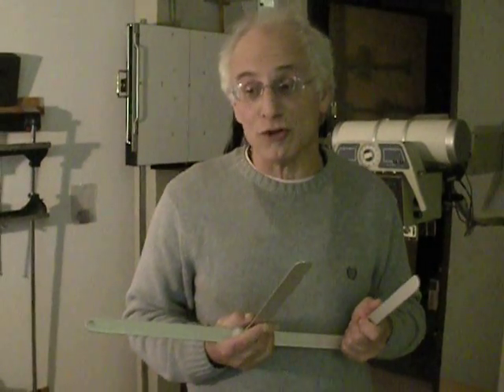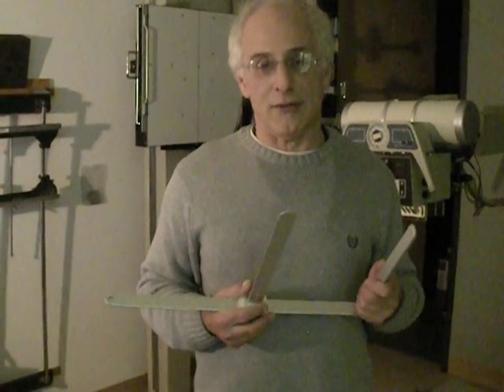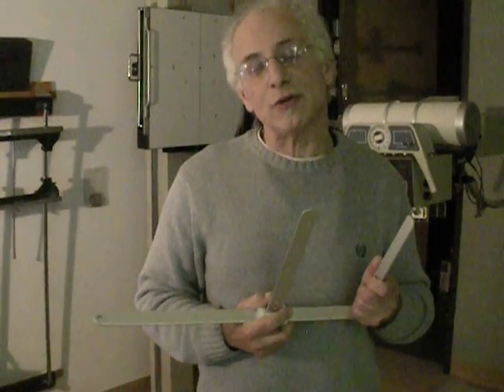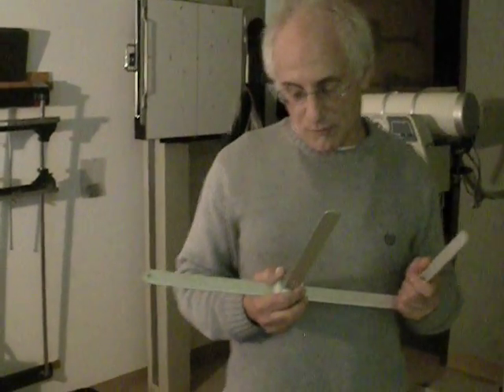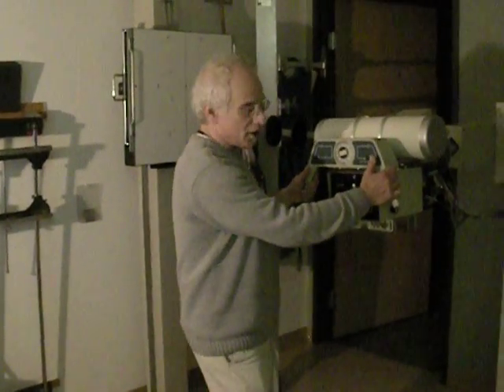We're going to begin with the basic minimal diagnostic series of a cervical spine 3 view. That would consist of an AP axial lower cervical, an AP open mouth, and a neutral lateral. And we will eventually add to that the flexion extension laterals and the oblique views. So we're going to begin with our cervical spine study, an AP cervical. Now at this point we're not certain who our patient is, and I'm going to demonstrate what I mean by setting up our field before we begin.